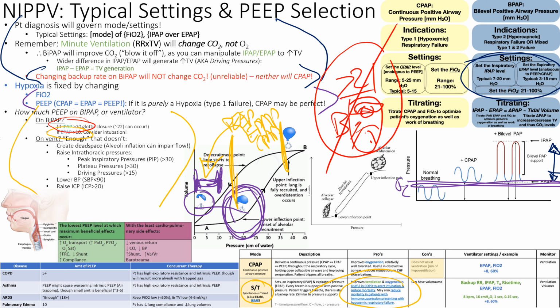Okay, so if they're on the ventilator, again, it's just enough PEEP. That's as much PEEP as you want, usually up to 24, 26 at the most. So PEEP is going to be great, and we'll talk about PEEP on the next slide as well. It's going to help open up more alveoli, improve oxygenation, and re-recruit alveoli that were closed shut before.